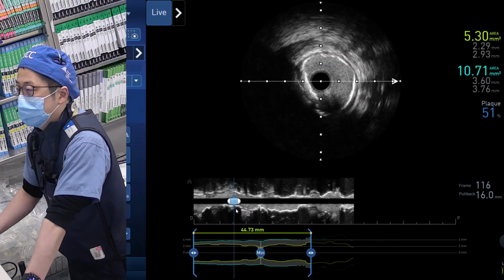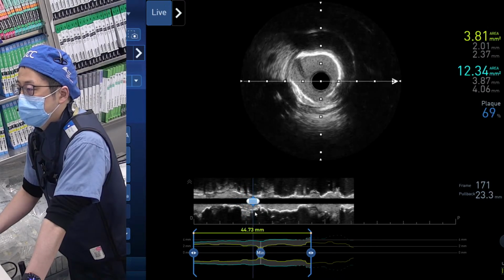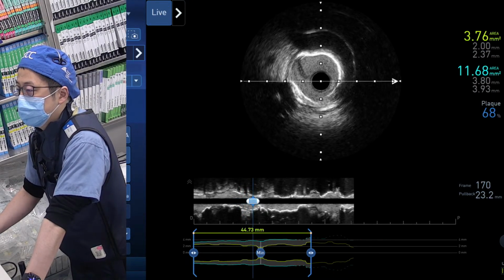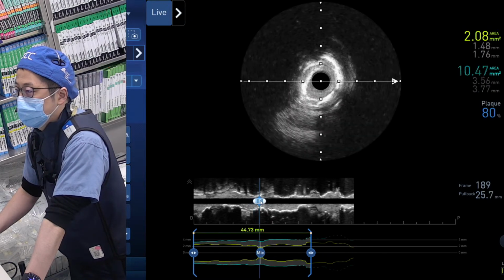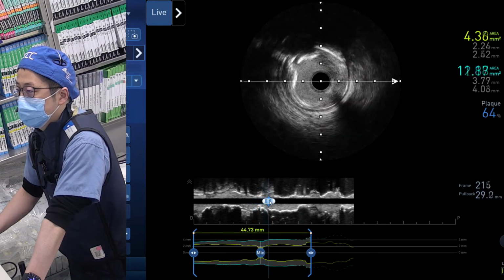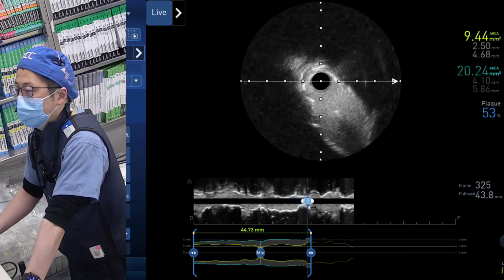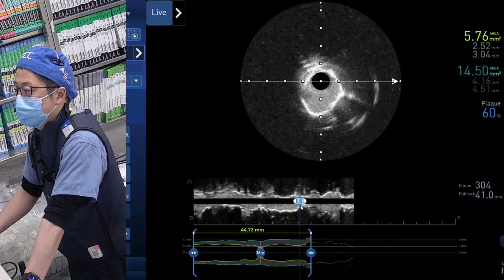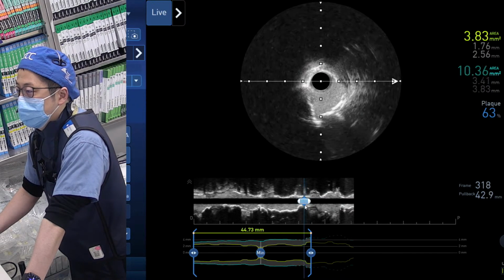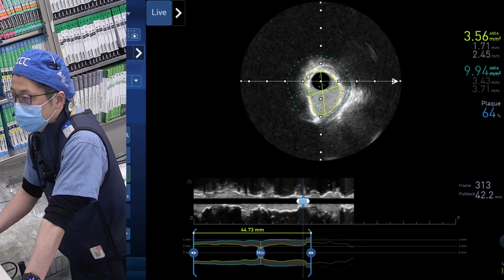And this is after the rota IVL? No. Rota. IVL did not go. Yeah. Flush. So there's some intimal dissection at the ostium. One second. Looks, yeah, this is the ostium. Yeah, that's a tight area. I think that's nice. Ostium is good. Yeah, it's true, it's AI integrated, but sometimes not correct, so I need to edit something.